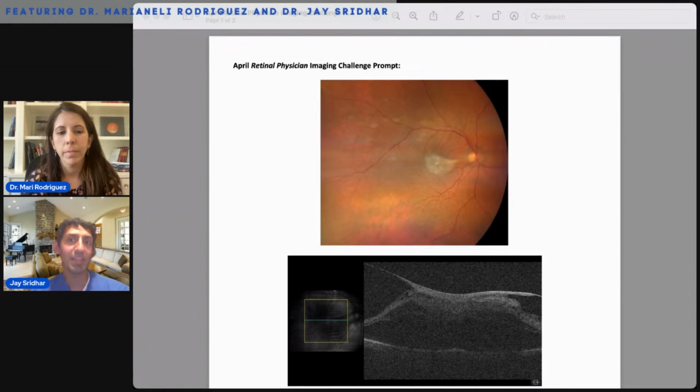I always reserve the right. Like if I see anything funky, like if the vitreous is super sticky in the mid periphery, if there's a break peripherally, then I will obviously shift course. But normally with ERMs, I don't shave in the periphery. Yeah, so I think that there's consensus about that.